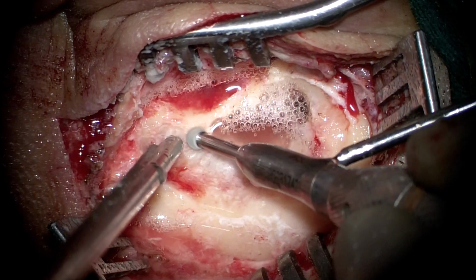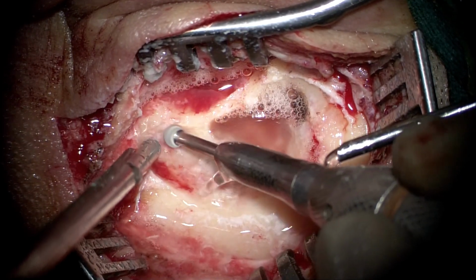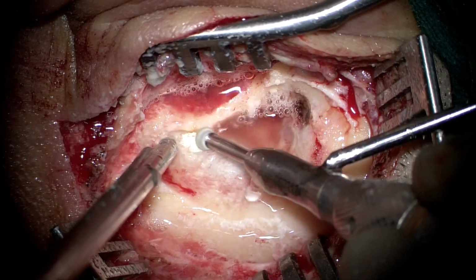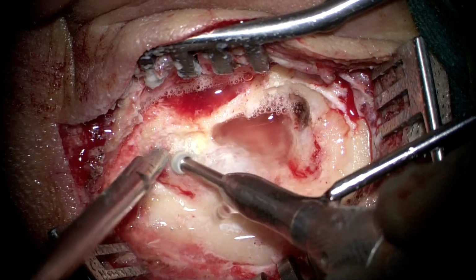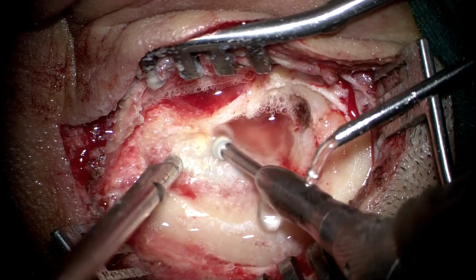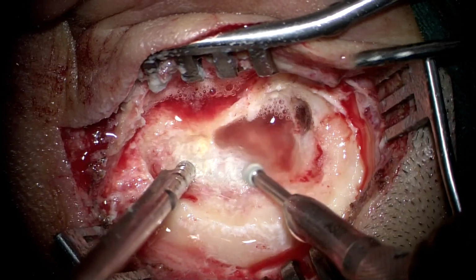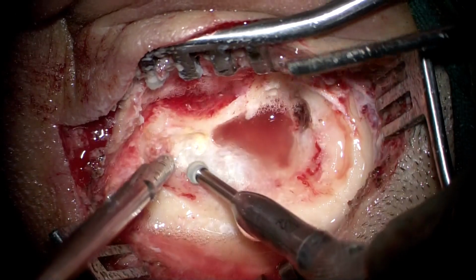Hence, an ablative procedure such as this cannot be done half-heartedly, where some bit of canals can be drilled and the rest can be left open because of lack of exposure. So exposure of the entire region has to be ensured before we even start drilling onto the canals. So we take more time here to expose the entire mastoid much more proficiently before we go down to drilling the canals.